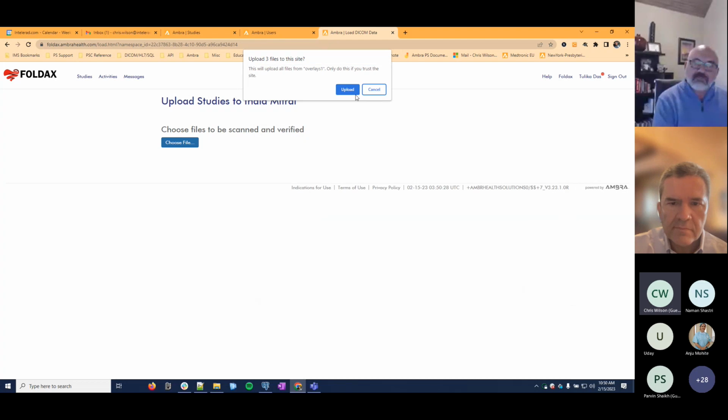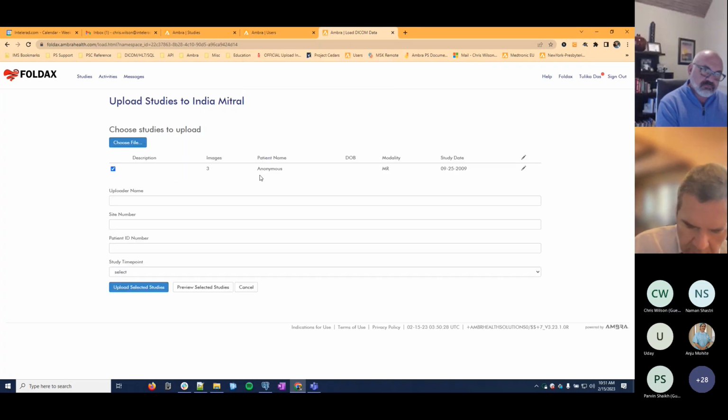Keep in mind that this needs to be DICOM, like we discussed previously, for it to ingest properly. Also, if you select something, it is going to do a hierarchy down from your selection. So if you just select your C drive or your hard drive, it's going to find every DICOM file in there. So make sure you're looking at the specific folder where the study you want to upload is being referenced from. It's going to do a quick scan and tell you the information that was present in that particular study.